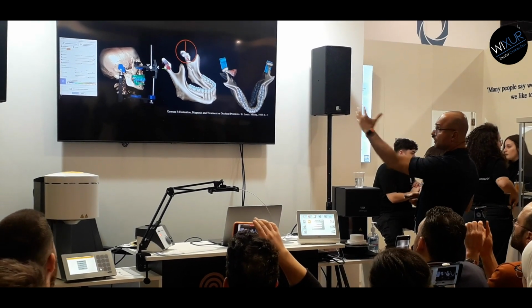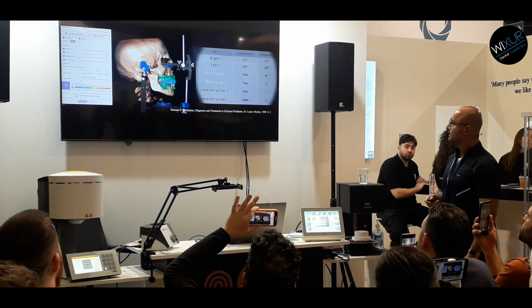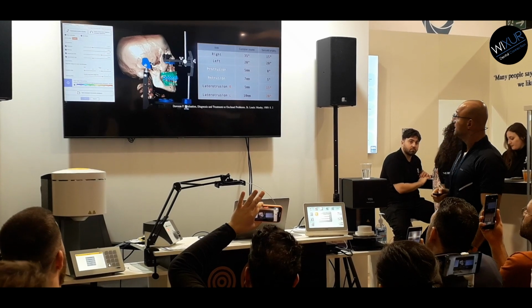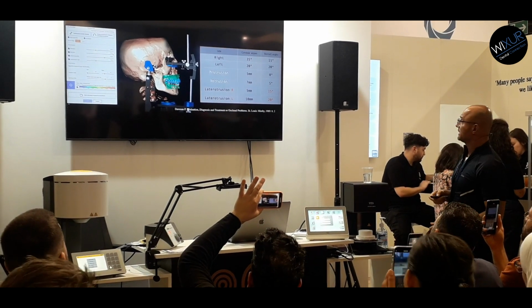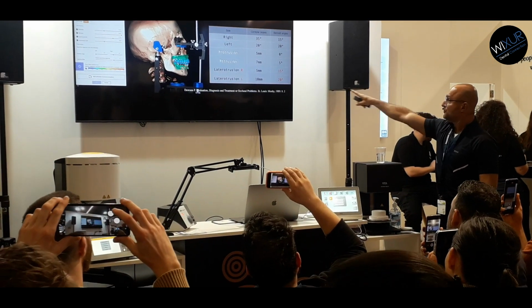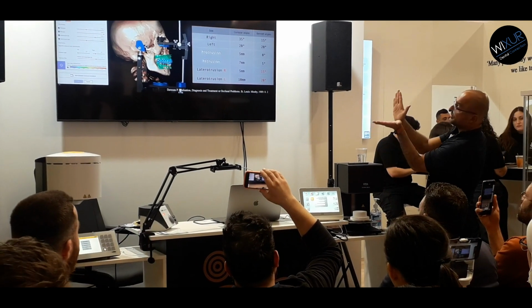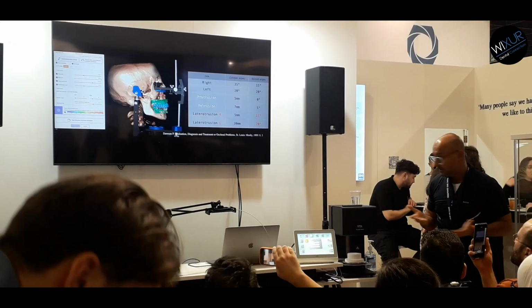So we can put all this information into exocad in this case. Right side, 35 degrees, condylar slope, and 15 degrees bennett angle, sorry. And when we go to lateral occlusion, you see I give a lot of freedom. 15 to 20 degrees. This is 90 degrees, this is 45 degrees, this is 15 degrees. So a lot of freedom.